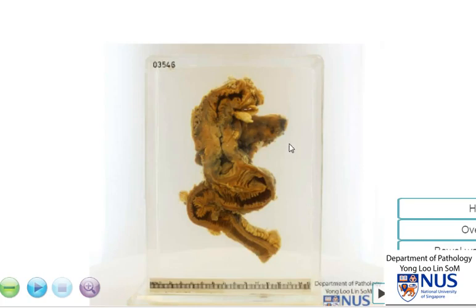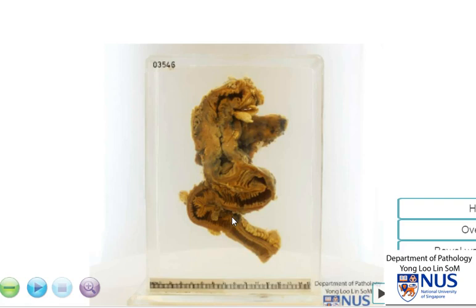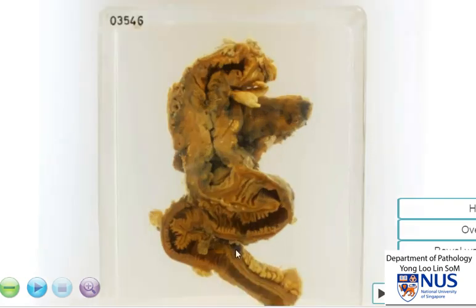This is the specimen of a bowel, and you can see that it includes the terminal ileum as well as the cecum and ascending colon. At first glance, it is quite abnormal in terms of the structure, and this is for several reasons.